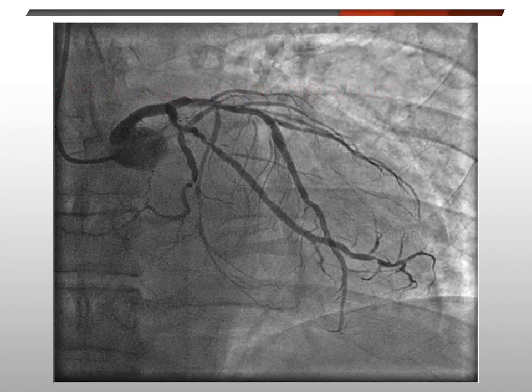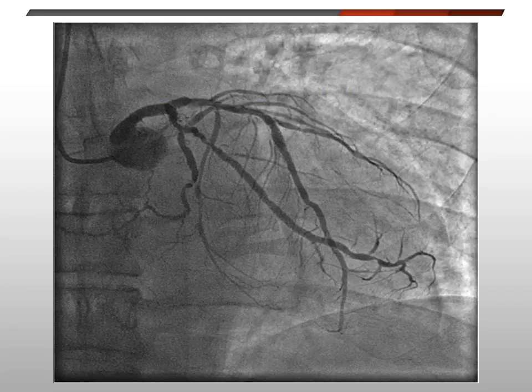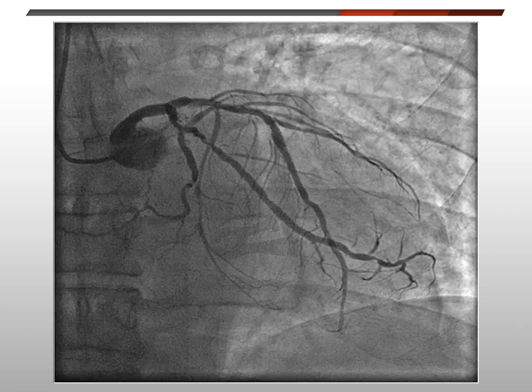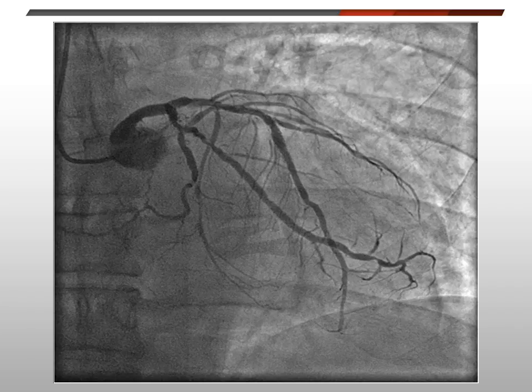In the hospital he underwent coronary angiography. Coronary angiography showed normal left main artery. The circumflex artery had 40% stenosis in the proximal segment involving the bifurcation of the obtuse marginal 1 branch. The obtuse marginal 1 artery had about 60% stenosis. The distal circumflex artery had diffuse severe atherosclerosis leading to obtuse marginal 2.